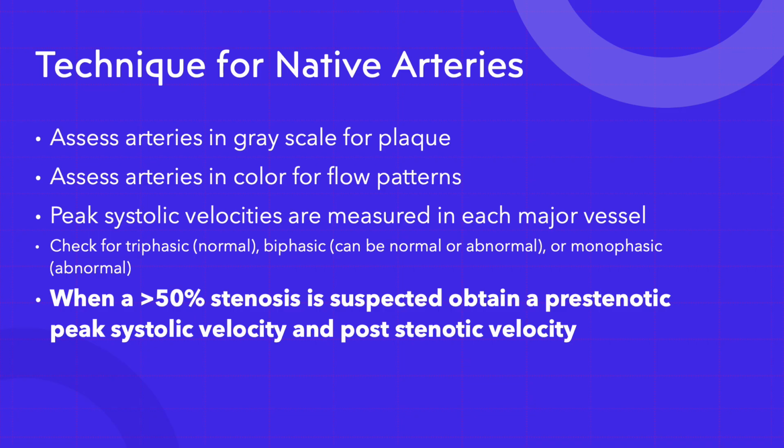You're going to get a Doppler velocity prox to that point. So move up just proximal to that stenosis. Prox stenosis, stenosis Doppler, post stenosis Doppler. So when you see a stenosis, again, you pause and you Doppler before, at, and after the stenosis.